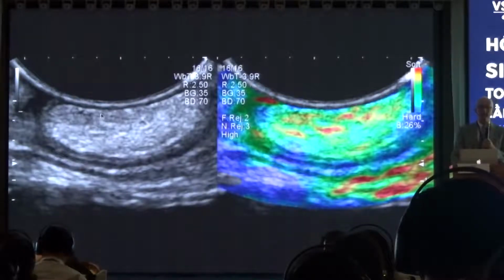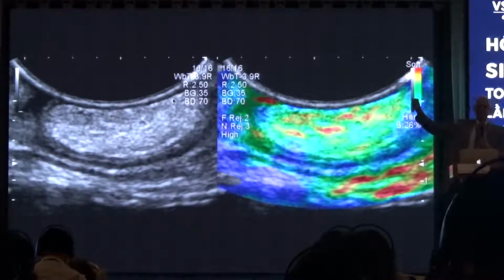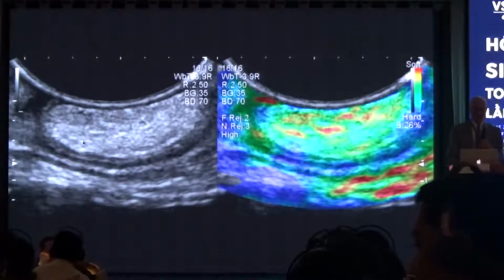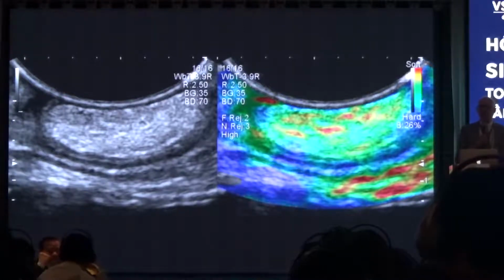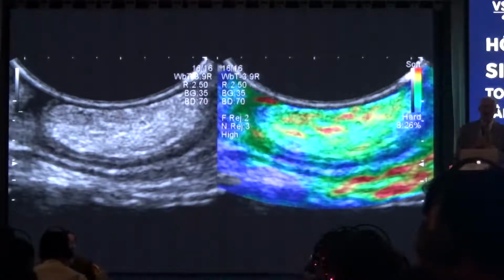Here you can see a lipoma in the stomach. And as we know that fatty tissue is soft, we would love it if that lipoma displayed soft tissue as a proof of feasibility. And you can see nicely it is green and red, it is softer than the surrounding. So this lipoma in the inner layers of the stomach, without any biopsy, can be judged as soft, typical lipoma, and this has a consequence. We do not need to perform surgery, and we do not need to perform biopsy.